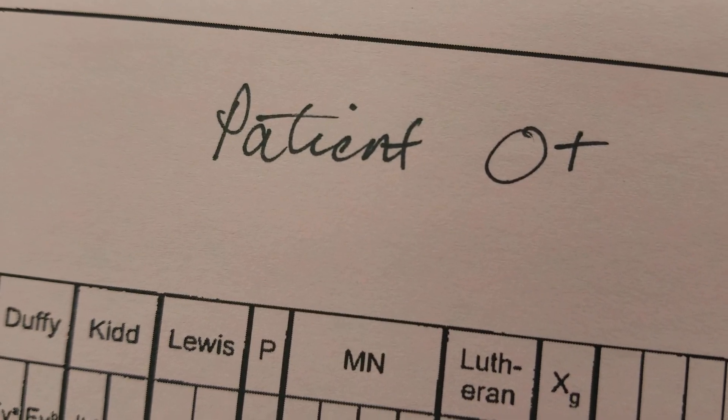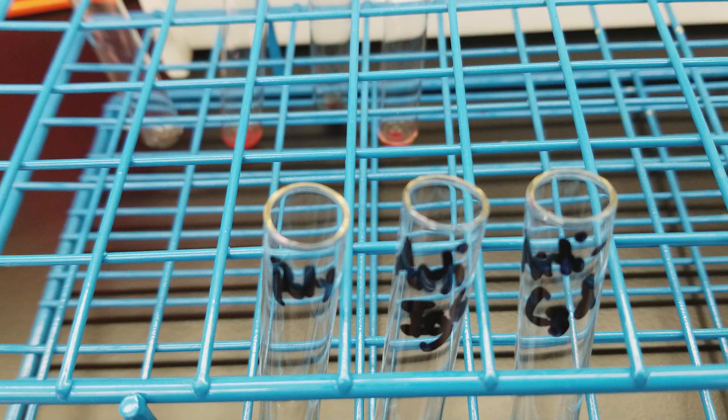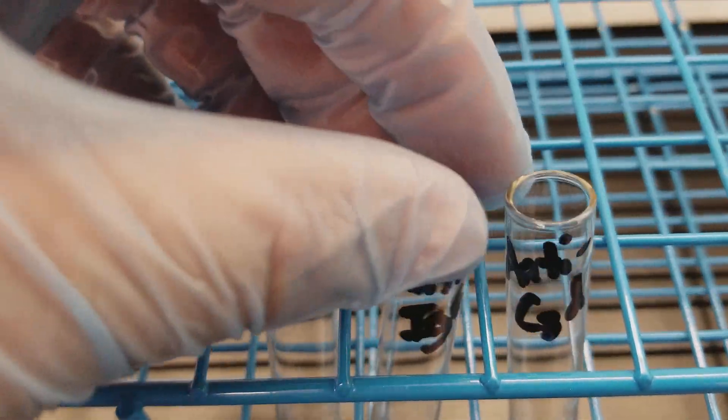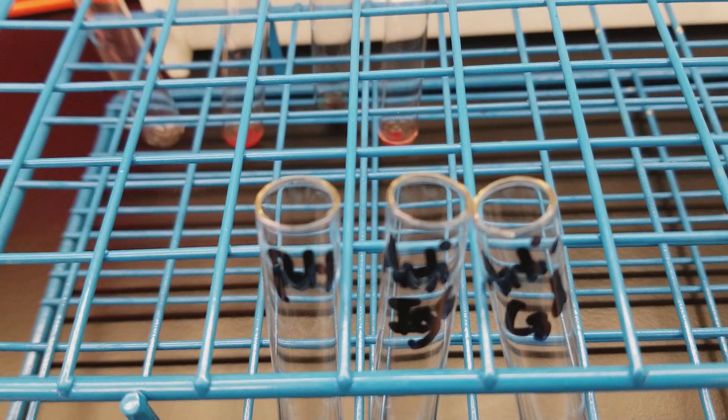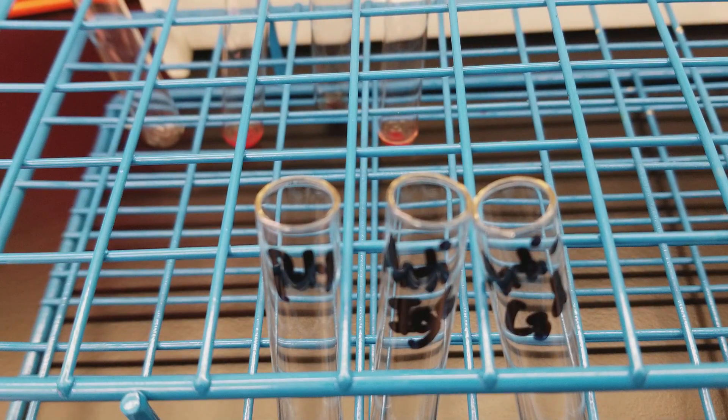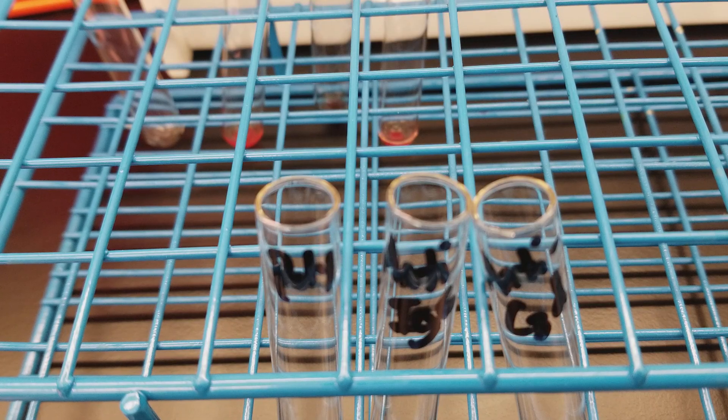This patient is O positive and I have already labeled my tubes with polyspecific anti-IgG and C3D.